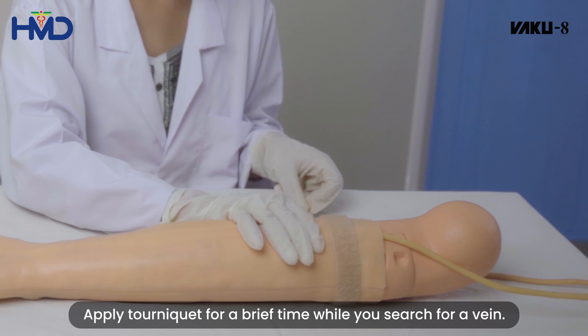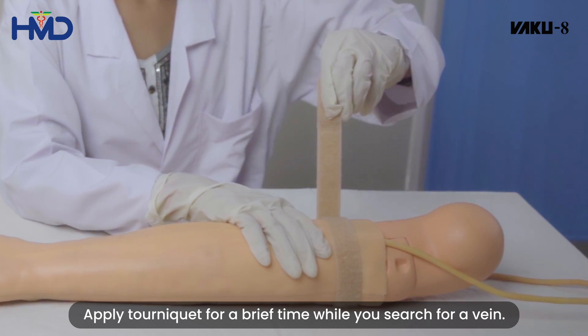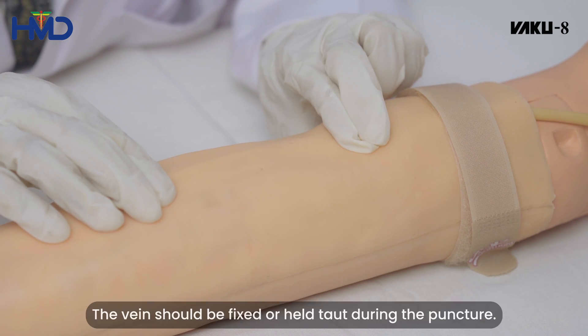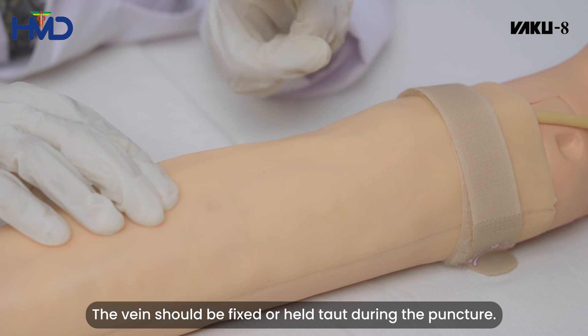Apply the tourniquet for a brief time while you search for a vein. Palpate the area to locate the vein for venipuncture. The vein should be fixed or held taut during the puncture.